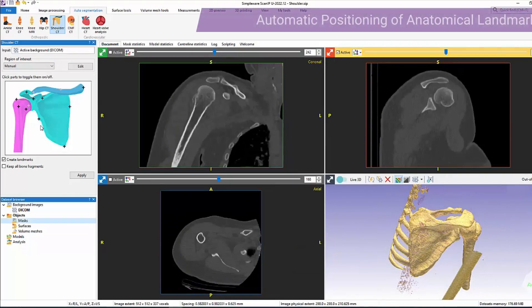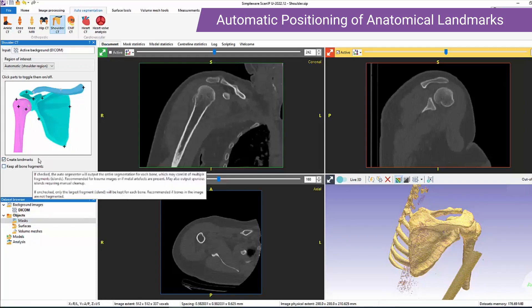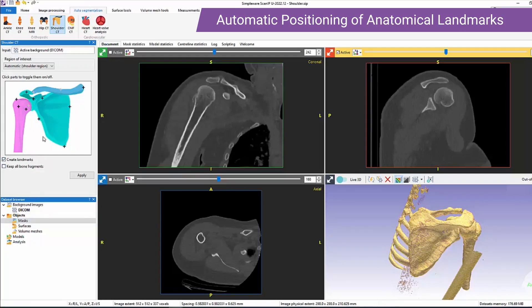Another great aspect of our auto-segmenters is the automatic positioning of anatomical landmarks. We have the option to toggle this off and on. Additionally, we can specify the keep all bone fragments option, which is very useful in fracture cases.